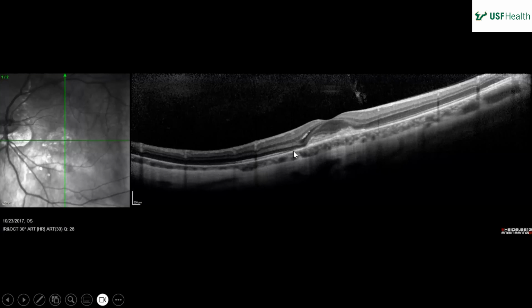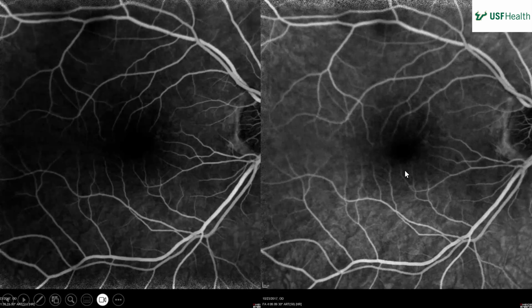Because the patient's myopic. This is a weird OCT. Patient's very myopic. They also have their RPE is very thin. So you're actually seeing vitreous detail, retina detail, and scleral detail, which usually you don't see. And in swept source OCT, eventually we'll see this, but in regular you don't. But yeah, you don't normally see the posterior ciliaries that nicely. Kind of cool. Anyway, it's not related to the case, although a little bit maybe. Go ahead. Just reading a paper on that.